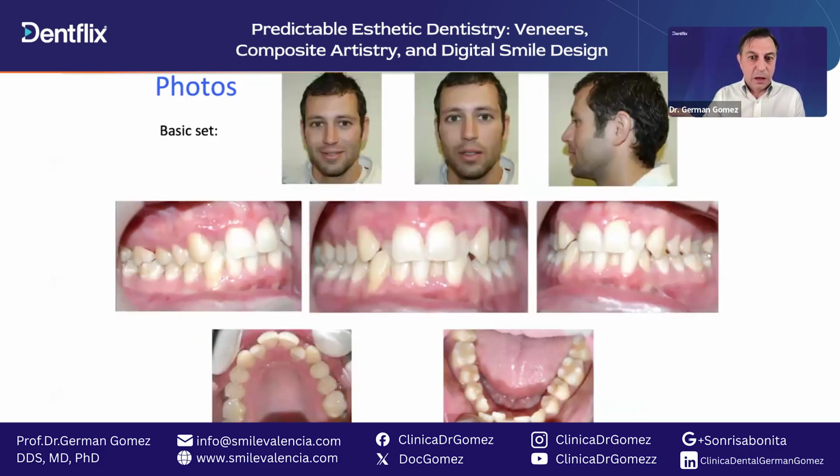That's the minimum that we have to take: a smile, then a normal position from the side, and then intraoral from the side, from lateral, from the front, from the other lateral, upper and lower. That's really the basic thing. The DSD concept, Digital Smile Design, has other pictures from different angles that also show us the facial incorporation of our smile design into the face later.